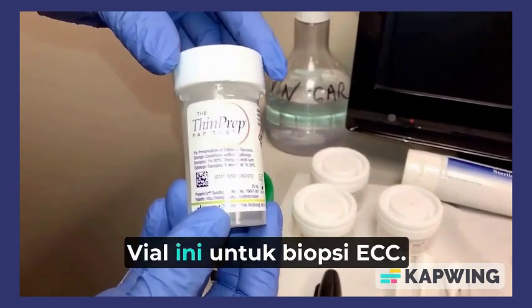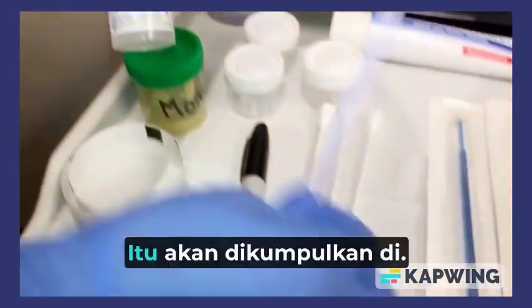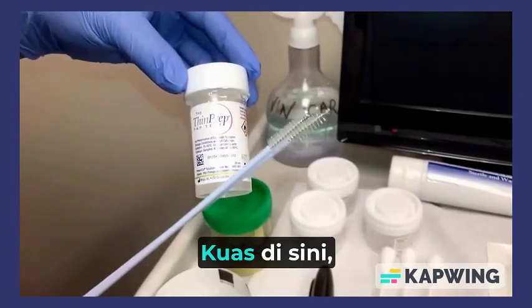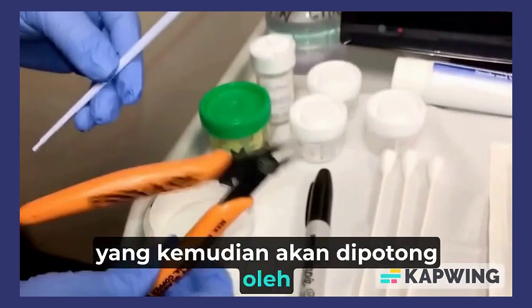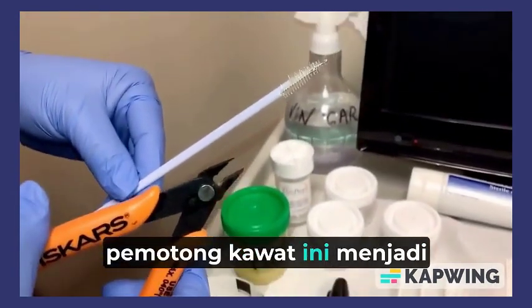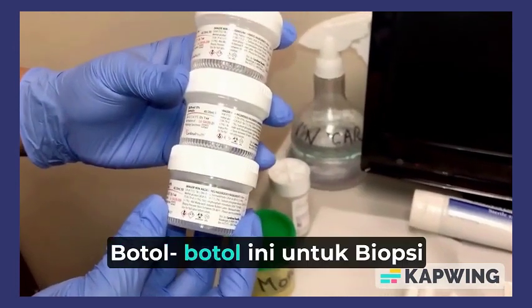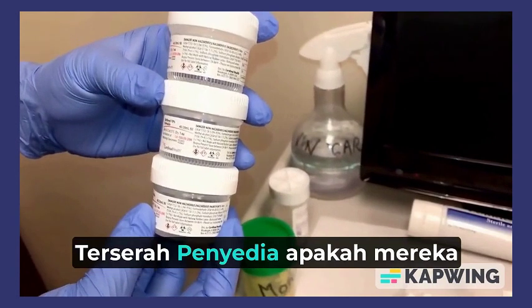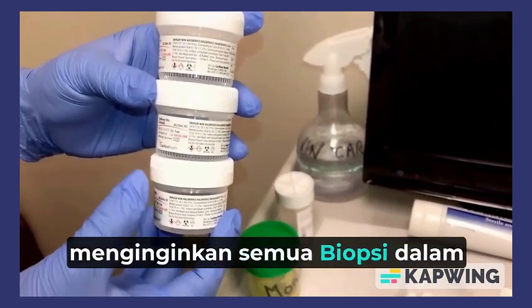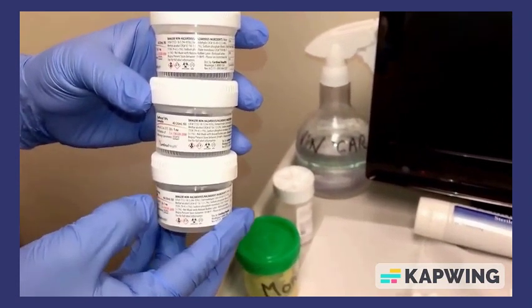This vial here is for the ECC biopsies. Those would be collected on these brushes here, which would then be cut by these wire cutters into this vial here. These vials are for the biopsies that are taken by the provider. It is up to the provider whether they want all the biopsies in one container or separated individually.